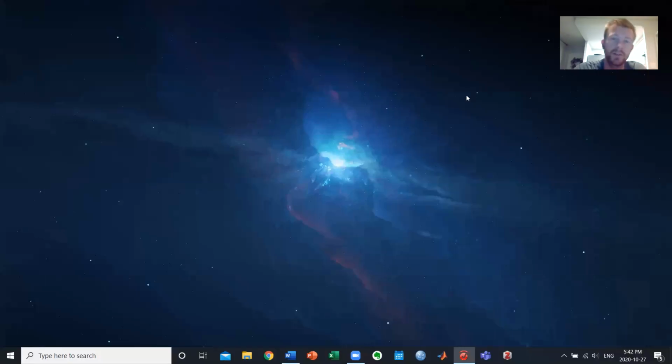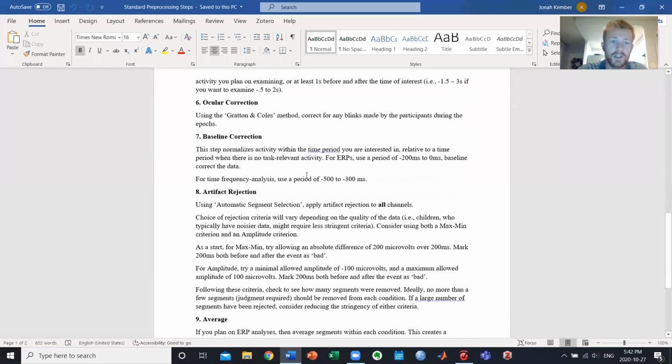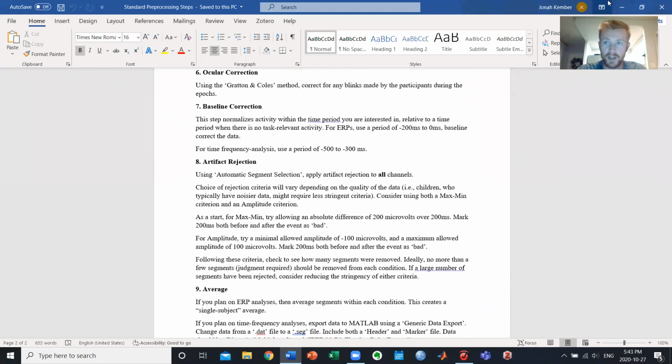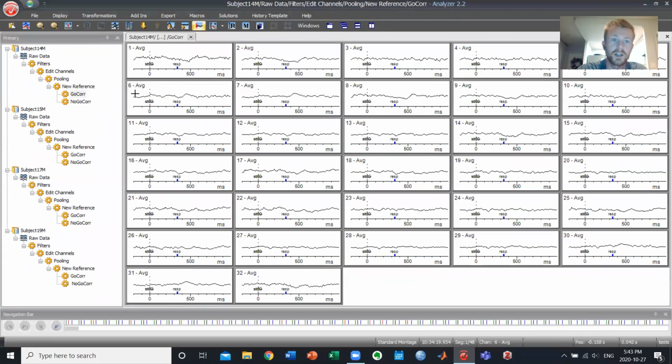All right, so now that we've segmented all of our data, there's just a few steps we're going to do to clean it up before we go on to creating single subject averaging. Those steps are an ocular correction, a baseline correction, and an artifact rejection. So here we are, we just segmented into our two conditions, a go condition and no-go condition.